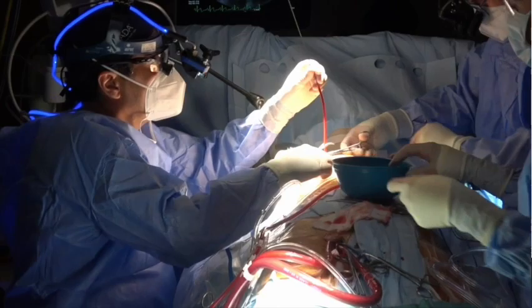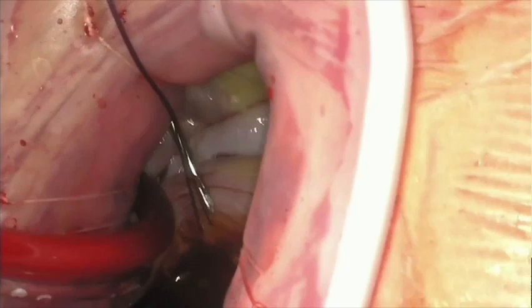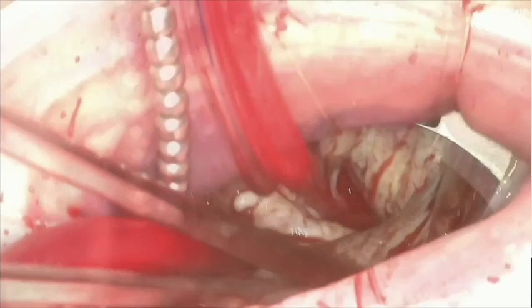We pull the cardioplegia line and we are ready to clamp. This is the Cygnet clamp — it is easy to enter the transverse sinus. This is the best clamp here as it does not require additional holes, has no conflict with the superior vena cava, and no obstacle with the left atrium retractor. Here we open the left atrium, retract it, and the exposition of the valve is completed with the placement of posterior annular sutures.